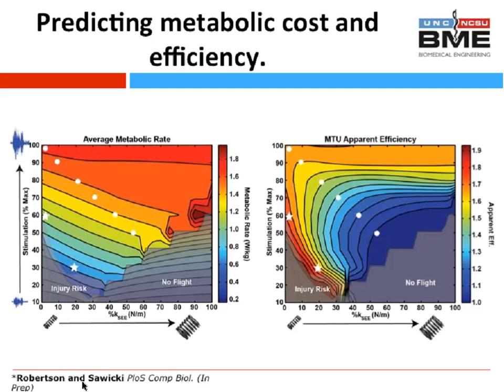But if you made things stiffer than that, people would have to turn their muscles on more to keep hopping. So I don't know exactly where the value is, and our best estimate is that we're at the 2-star conditions in this space. But these are rough estimates. So I think the next studies are to actually go back into the lab and play around with different stiffnesses that cover the range along this x-axis that we're showing. Yeah, that would be cool to see.